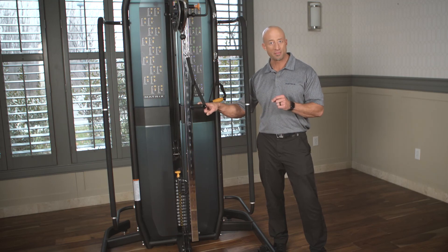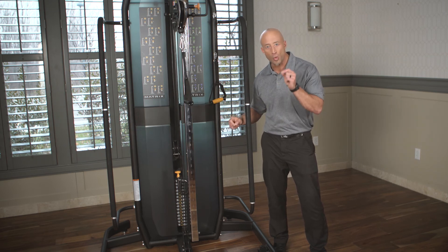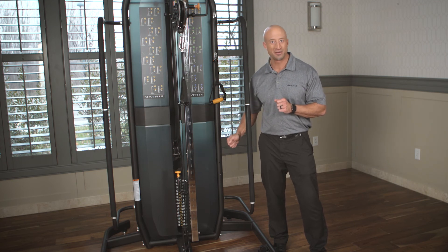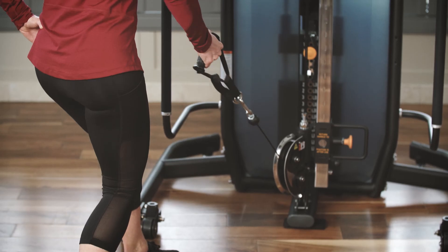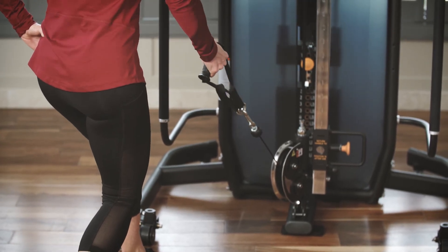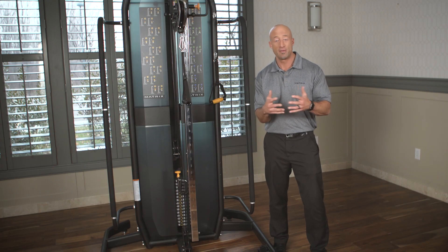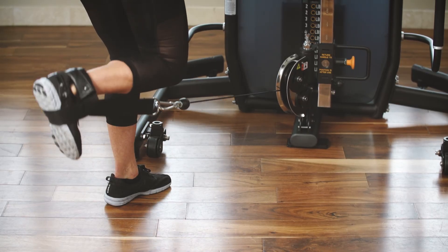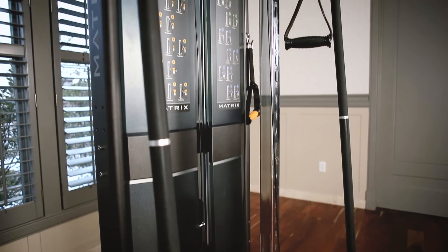We also have an optional increment weight system that allows you to go in one-pound increments all the way through the entire stack from top to bottom. So you have the ability to have progression and growth, and clearly identified markings for therapists to be able to write down and capture the amount of weight people are using. So while it's a very versatile and simple machine, it has some very unique features that allow it to apply in a lot of different markets.